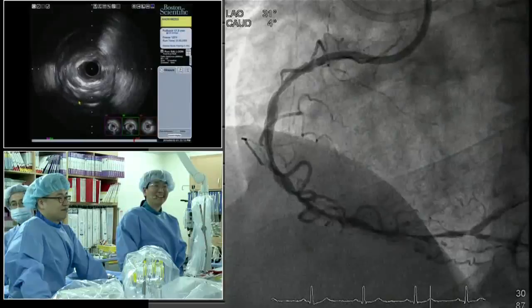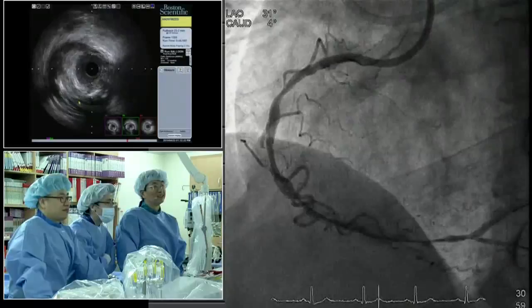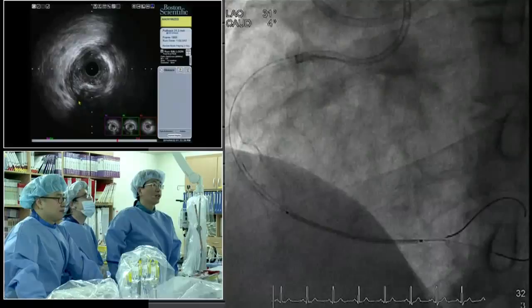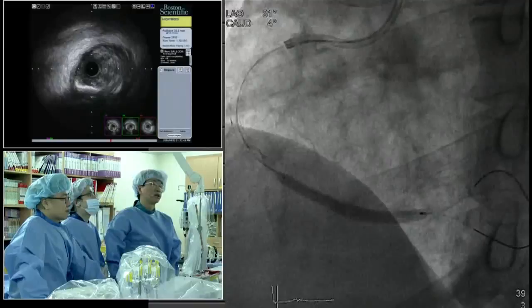This is a manufacturer's dream. No stents you're going to have to put in there. Yeah, from angiography we can find some PD branch proximally. So from the angiography, I wanted to put the stent, as you keep recommending. So we put the stent just proximal to the bifurcation, 3.0 by 38, up to 16. Vessel size is very big, around 4.0, because the remodeling index of the RCA is usually low.